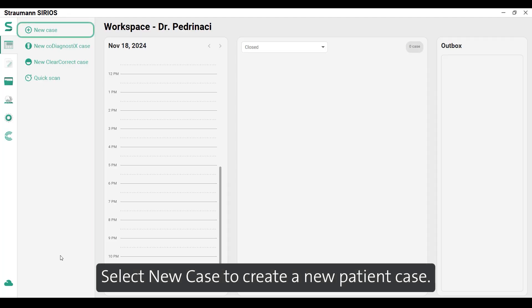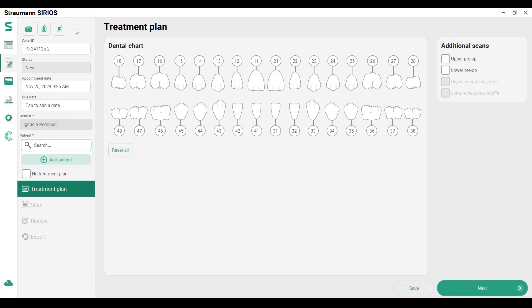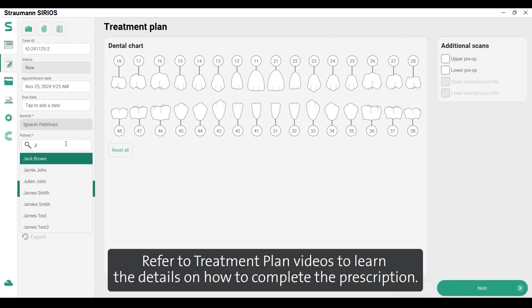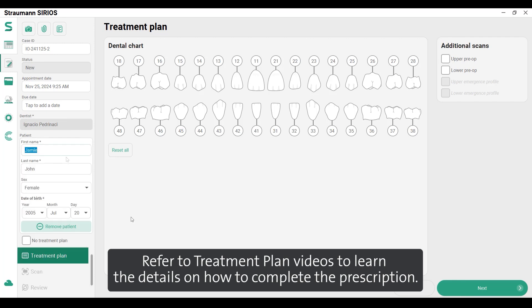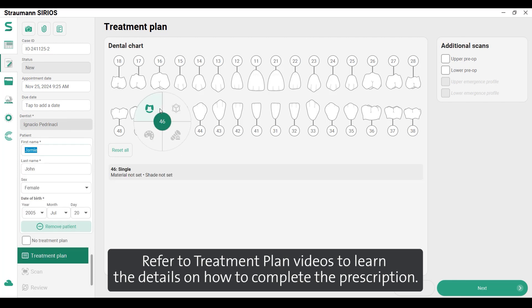Select new case to create a new patient case. Refer to treatment plan videos to learn the details on how to complete the prescription.